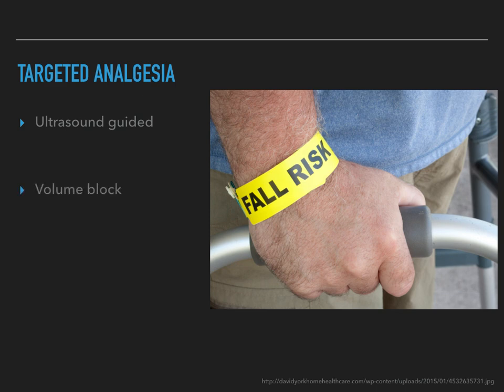For obvious reasons, when introducing a large needle into the chest wall, this block mandates ultrasound guidance, both to identify the proper plane and to stay remote from the pleura. As with other volume blocks, i.e. the fascia iliaca, the idea here is to deposit a large volume of dilute anesthetic into a space containing multiple nerves, in this case the fascial plane overlying the serratus muscle.